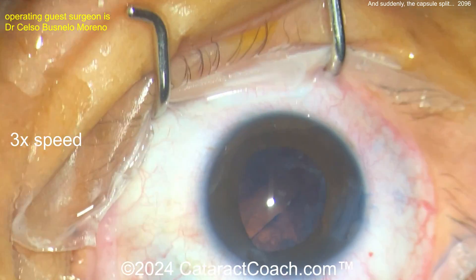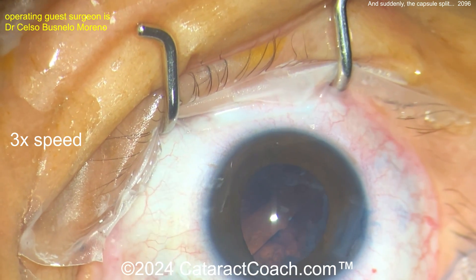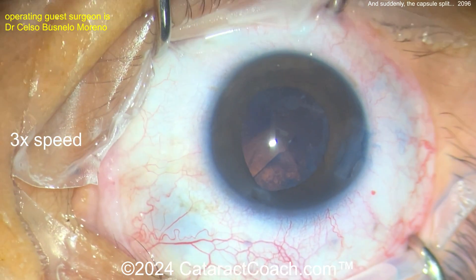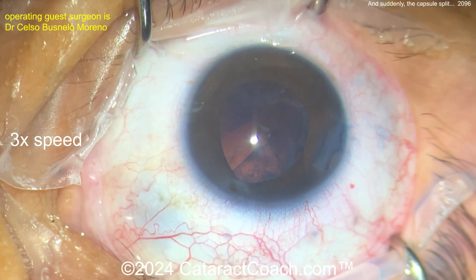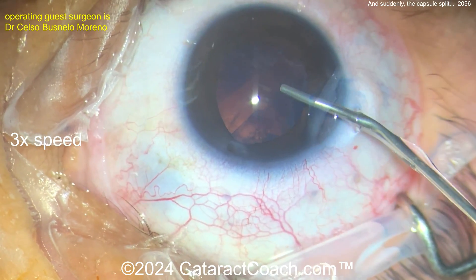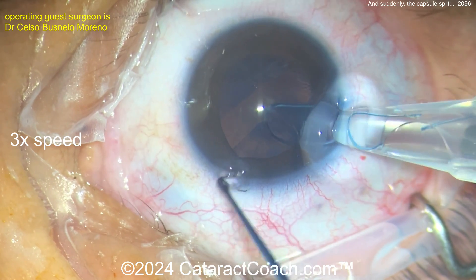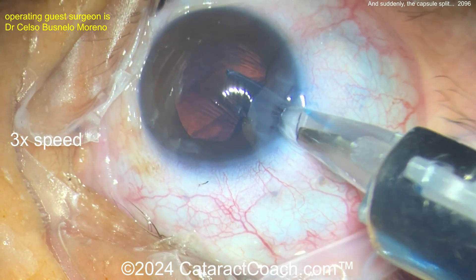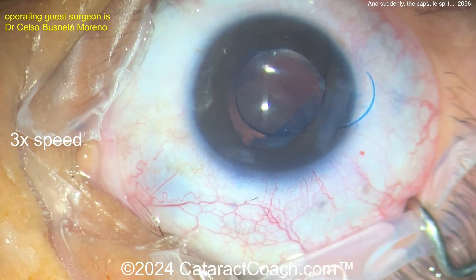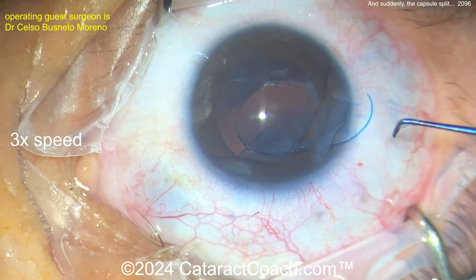The surgeon is probably loading up a lens — that's our little delay here, switching over to the I/A handpiece. I got the whole video sped up to 3x so I can show the whole thing; I'm watching with you for the very first time. Total surgical time was about 18–20 minutes, sped up to about 6 minutes here. Now enlarging the incision slightly — that probably means a three-piece lens. A little more viscoelastic. Coming in with the three-piece lens: remember, the leading haptic should go in like the number seven — the 'seven-L rule.'